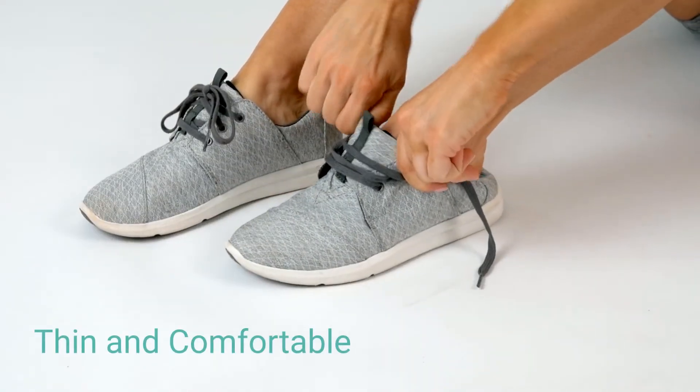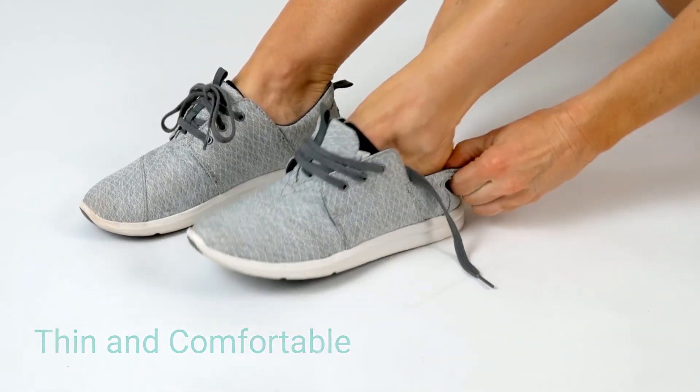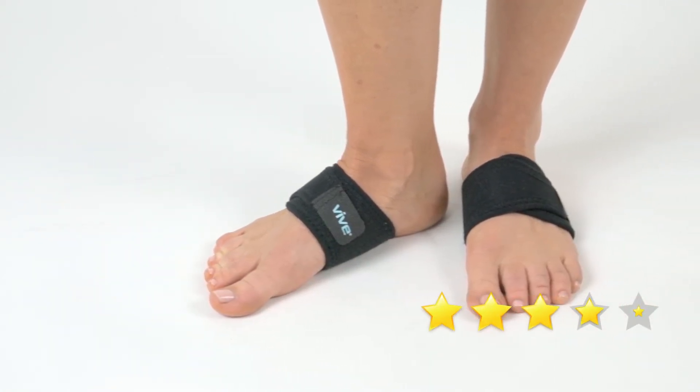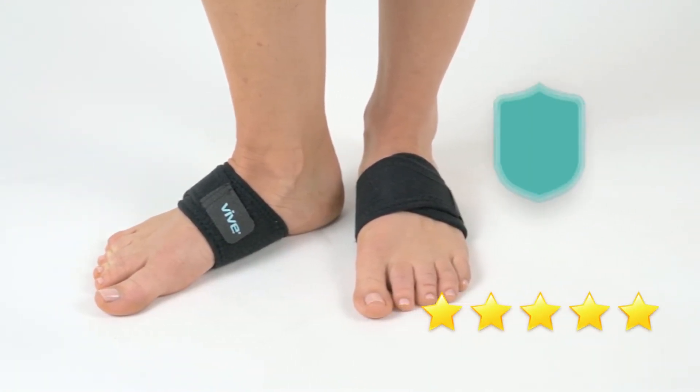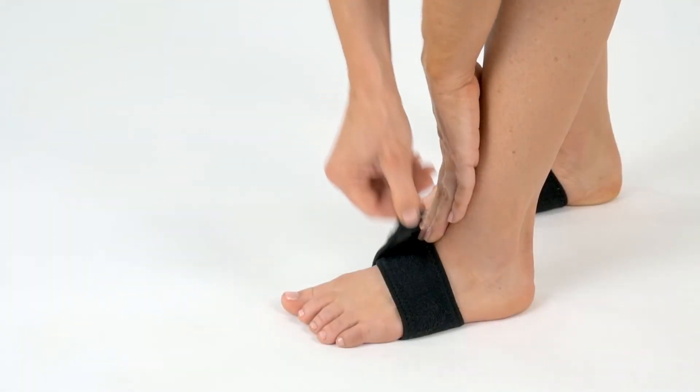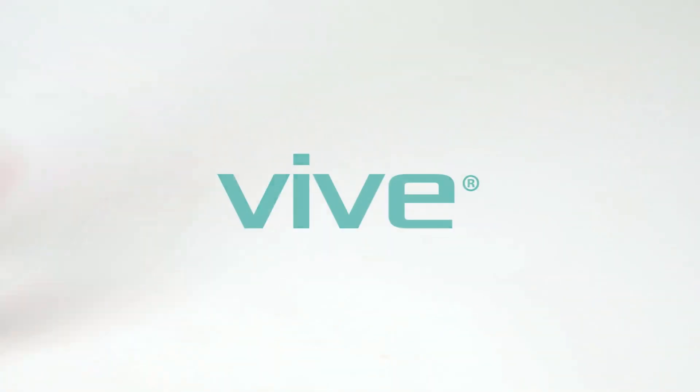The thin, comfortable design easily fits in most shoes and sandals. The Arch Support Brace by Vive is trusted and proven — there are hundreds of 5-star reviews. Plus, it's backed by an unconditional 60-day guarantee. You can't beat that anywhere. So confidently order your brace now and experience the benefits of arch support.